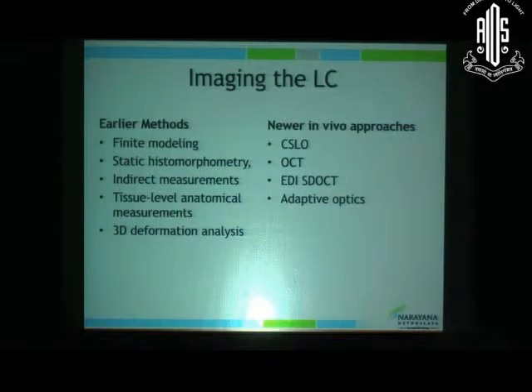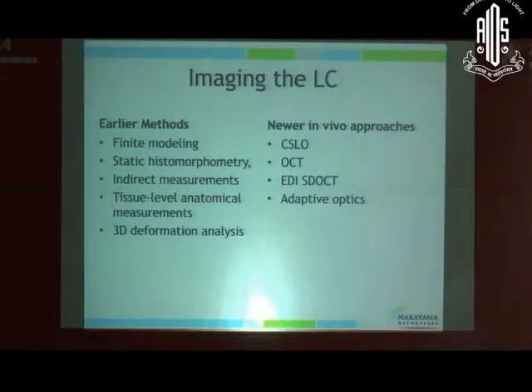But now with the CSLO and with some of the OCTs, with the enhanced depth imaging, spectral domain OCT software and adaptive optics devices, that has actually changed.